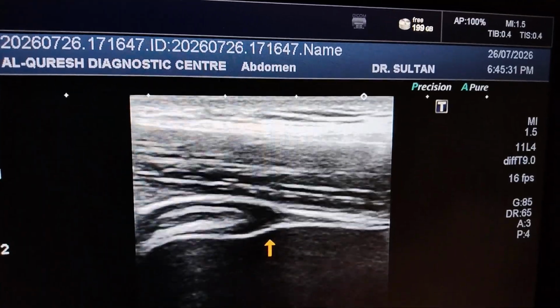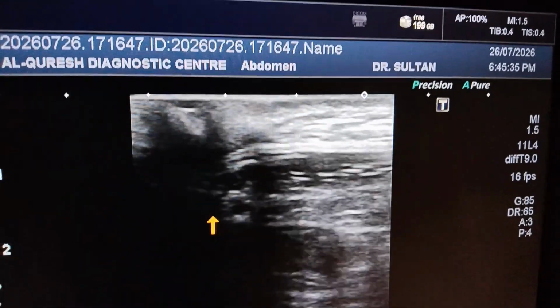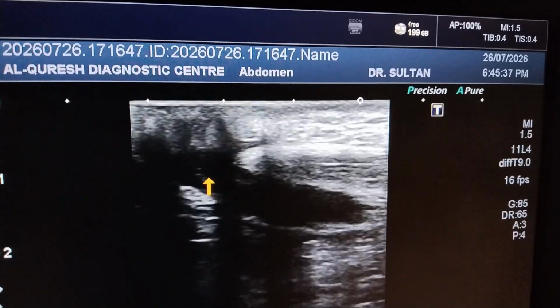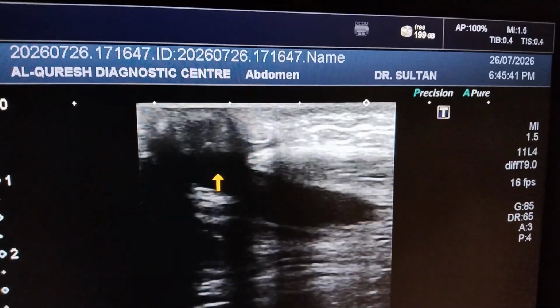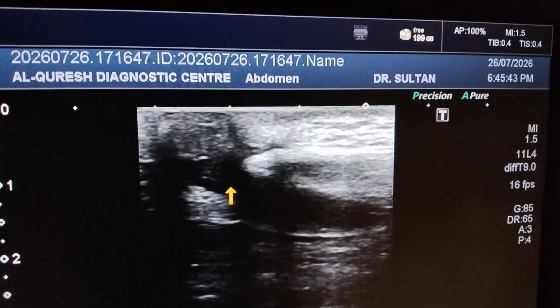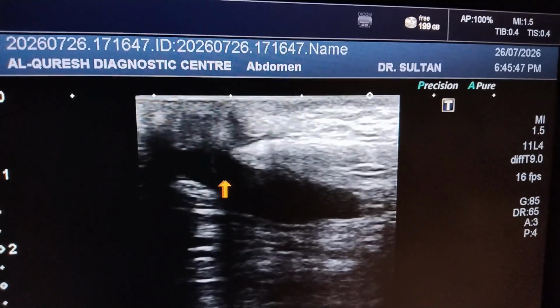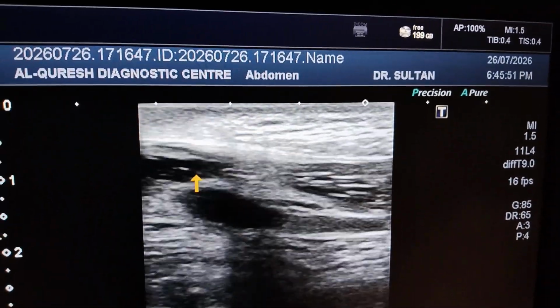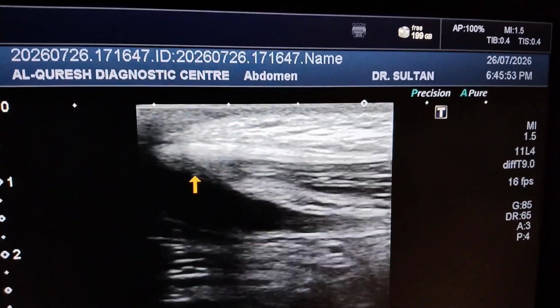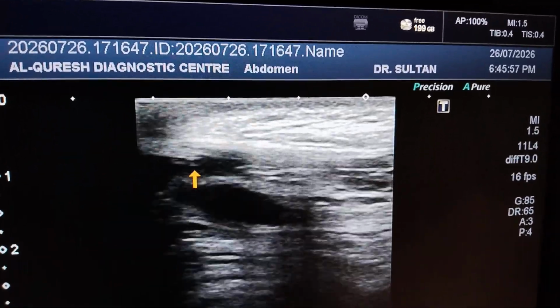So here it is closed while it is open at the umbilical side. From here it is giving the discharge. So this sinus may be due to the infection, as we have seen the blood flow. This is producing the discharge. So this was likely suggestive of the urachal sinus, not patent urachus.